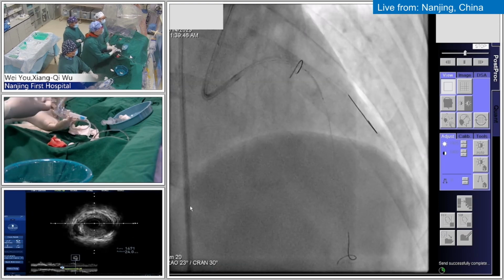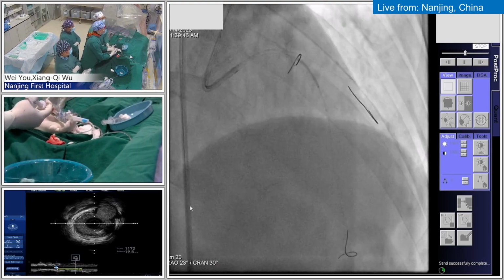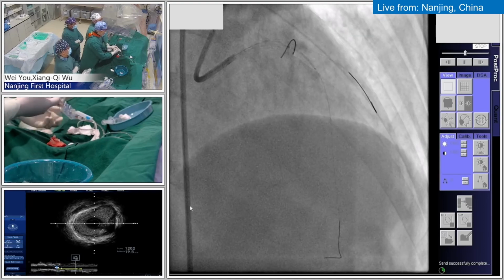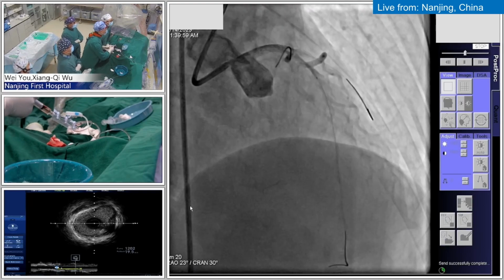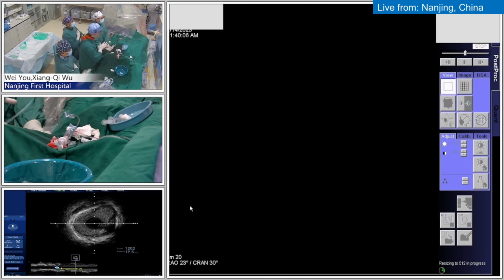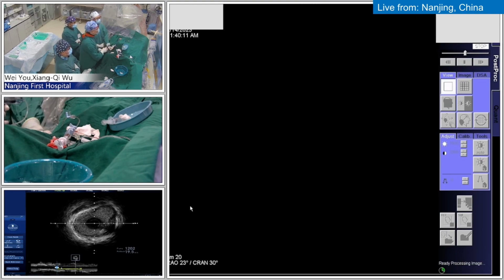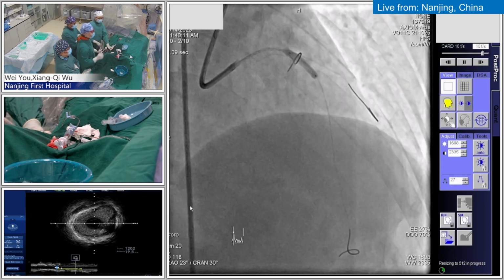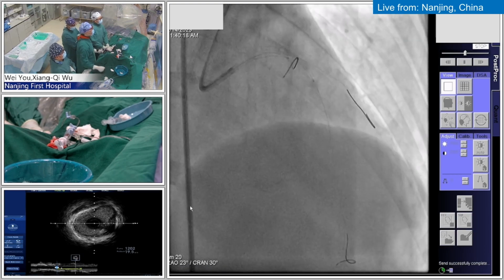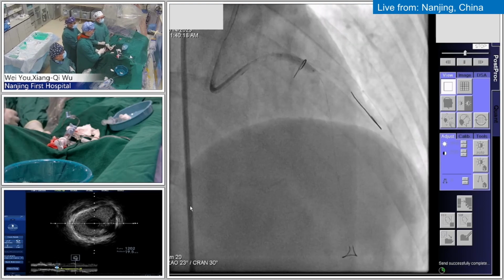So this is just nearby the middle segment. Maybe a bit more, right? Take the picture, please. Okay, ready. Take picture. So, Professor, I think here is good, right? Looks all right. Go. Going up to 6, 8, and 10. The question is, could you even have used a longer one to have covered the entire mid portion also? But let's see how it looks. Going up to 10, 12. Okay, done.